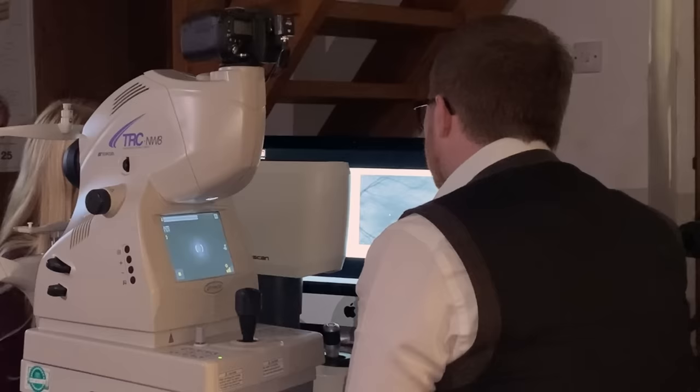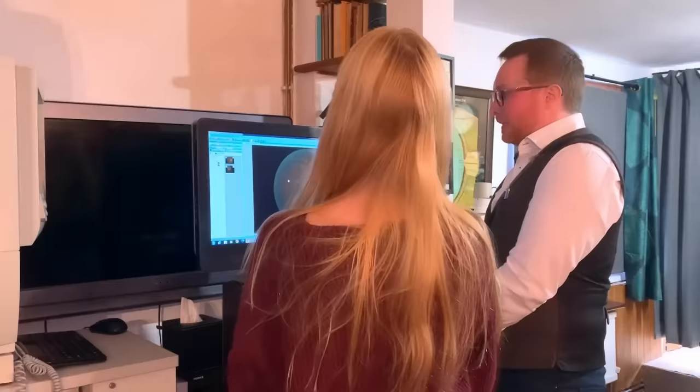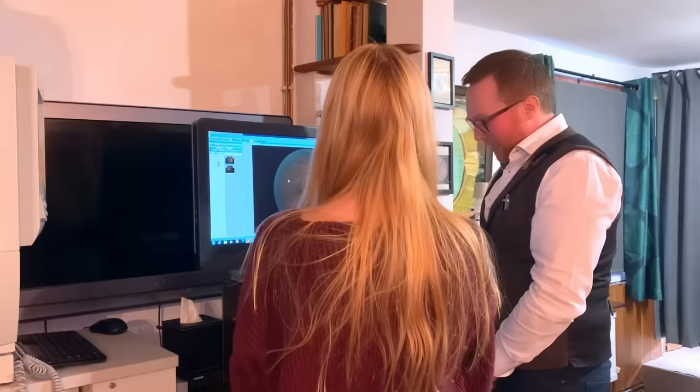So we'll save those. And then if you wanted to come and have a look at the other machine, we can have a look at the photographs and see what's going on there. Yeah. So this is a photograph of the back of your eye. Obviously it looks like the planet Mars, perfectly normal, everyone's does. So this is your right eye. If you imagine this is your eye looking out of the screen at us.